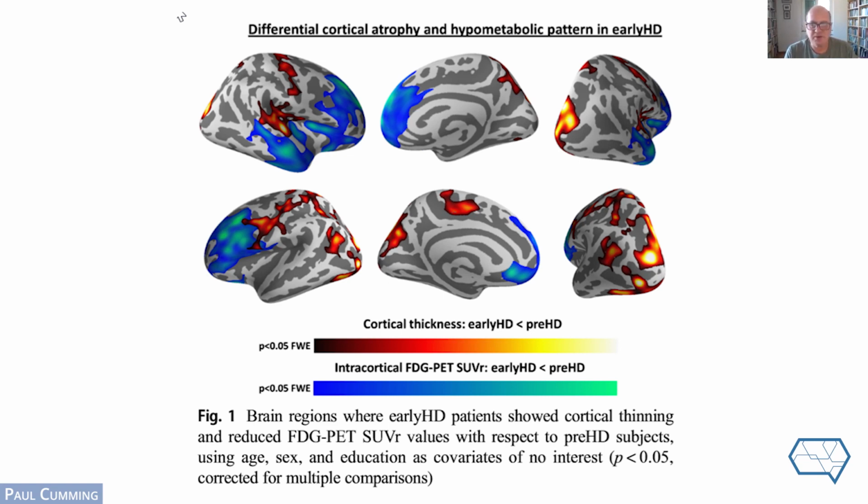And no doubt this accounts for some of the behavioral manifestations of Huntington's, which might involve disinhibition or impulsivity due to impaired frontal function. But it's interesting that it's physically separated from the points where the actual cortical loss is taking place. So it's probably a kind of downstream effect of the primary degeneration of the brain at that stage. Something to keep in mind is that the metabolic disturbance doesn't necessarily mean, in this case, atrophy, because the metabolic loss in the frontal lobe of these patients precedes the onset of distinct atrophy or tissue loss.